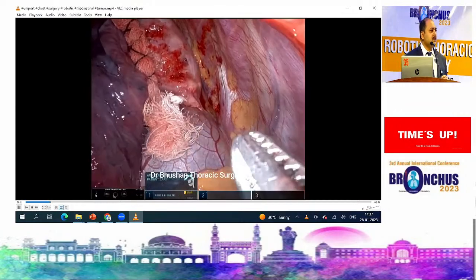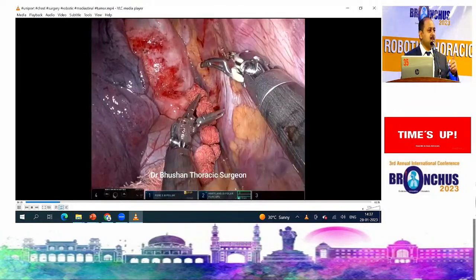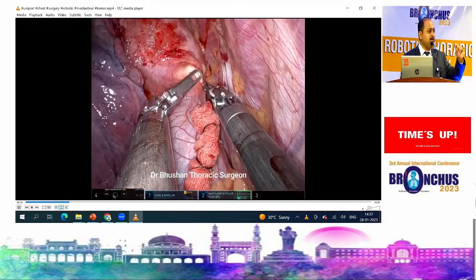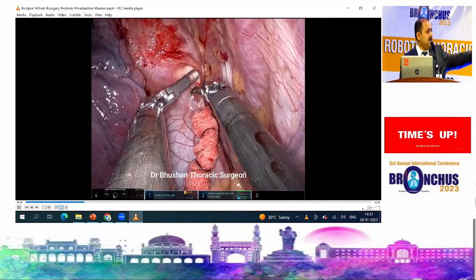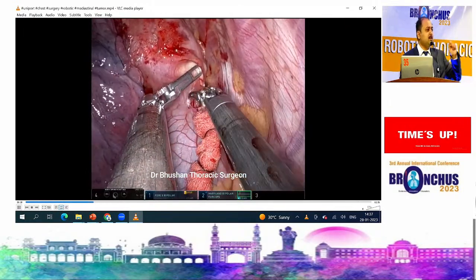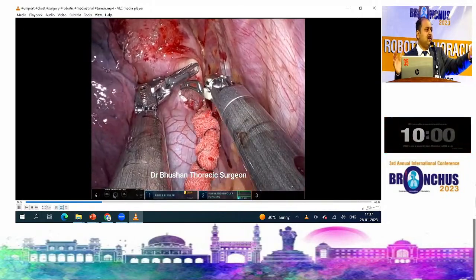One quick question. In your thymectomy, the complications which you said may arise, how do you manage them? Yeah, definitely. I have a video. After this session, I will show the video where I injured the innominate vein branch, the left branch. Immediately you should have a cigar kept inside. You have to make a cigar like this and keep it inside your thorax, and press with your grasper there.